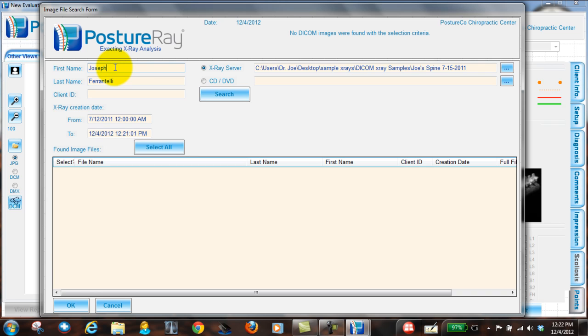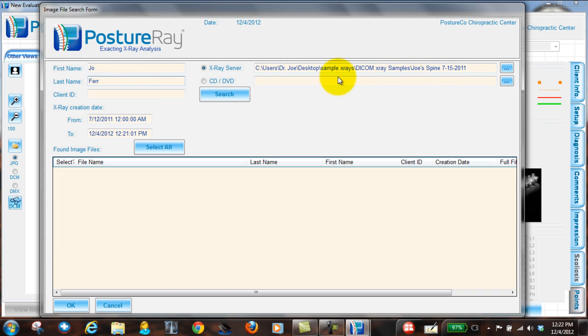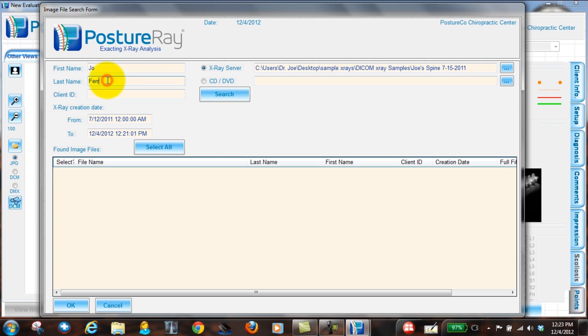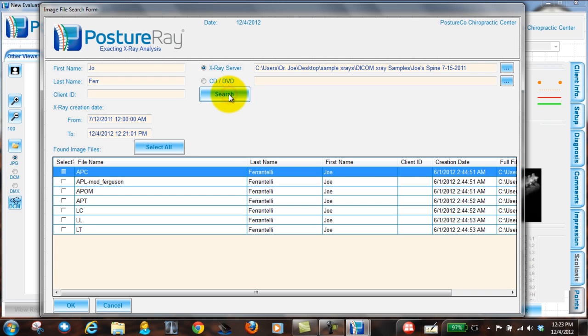So one of the things that you can do is if you're not so sure, let's go ahead and just put Joe and we can always shorten the last name because it's going to look to that location. So I put Joe and Ferrantelli, search within that date range and hit search and look at that. It found images.